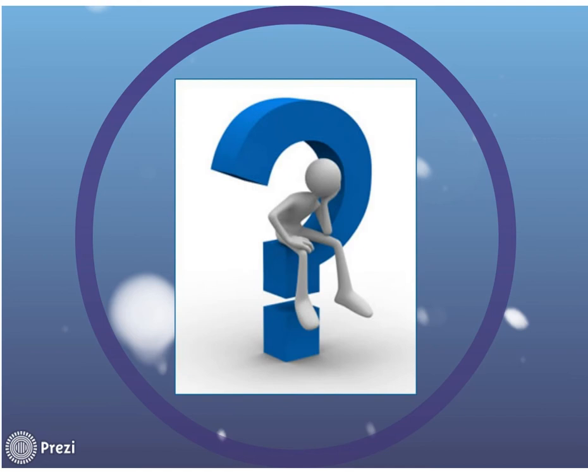Especially if you've got them relaxed, right? But one of the skills of finesse that you're going to need to learn is how to mask the patient. And these masks, we do have different sizes, but there's a typical adult size that comes on every machine. You have people with small faces and people with big faces. And learning to get it in the right spot on their nose and around their mouth and getting a good seal, if they have a beard or they have indentations or there's something on their face that makes it where you can't get a good seal, it becomes very challenging. So learning the finesse of that takes time. It's not easy, and it takes time.